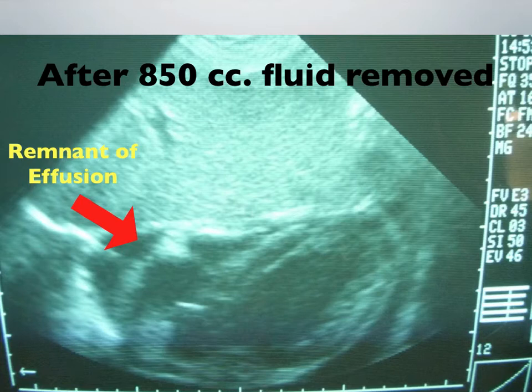And of course, in the US, we would be using sterile towels and ideally have this done in a cardiac cath lab. If it had to be done in the emergency room or in the intensive care unit, it could be performed there, and you would use as sterile a technique as you possibly could.